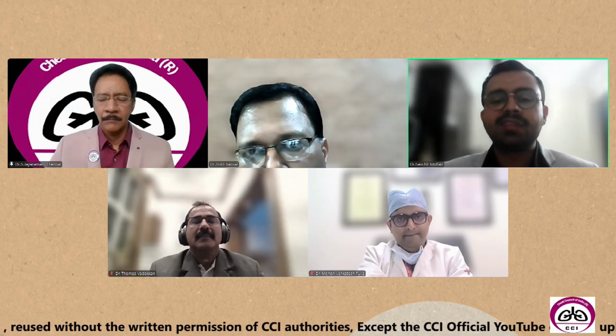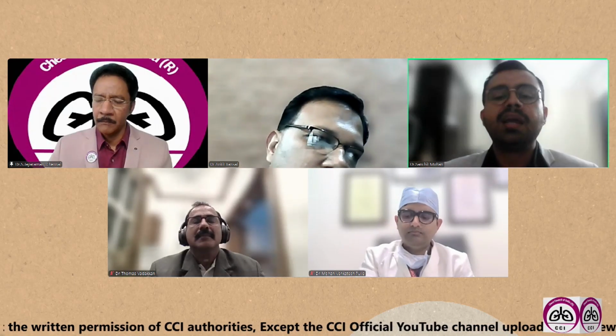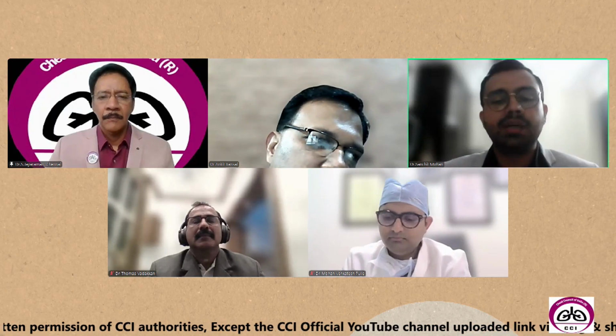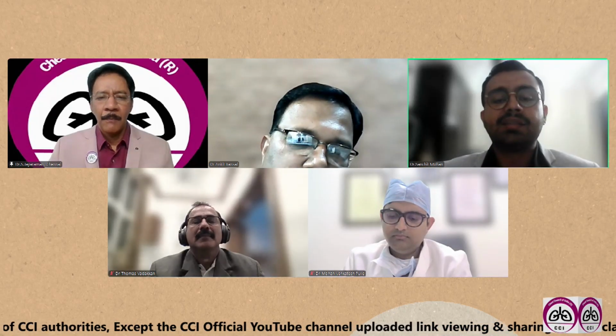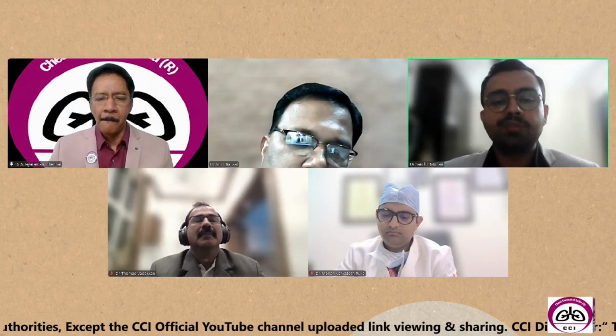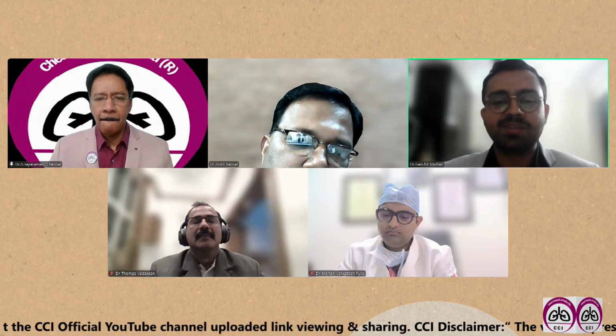Since the esophagus has a muscular structure, it easily gives way for the needle, and we can go directly into the level 5 or level 6 nodes. But whenever you are doing a transvascular needle aspiration, you should always do a ROSE, rapid onsite evaluation, when you're doing it.